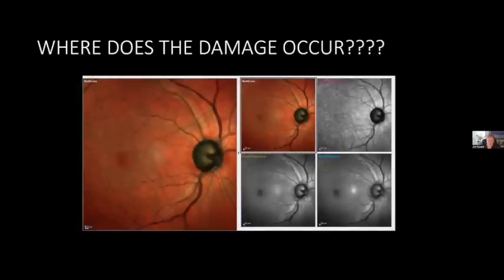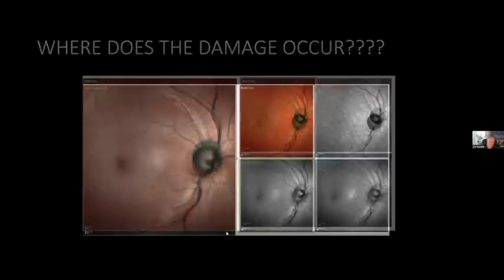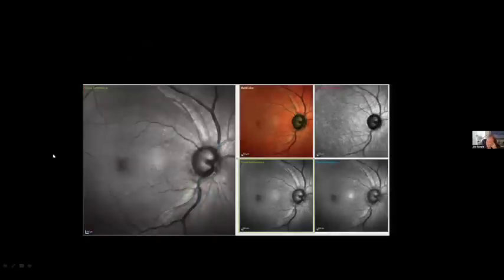This is a multicolor image of a patient who I've seen for years who has advanced glaucoma. Now, this is not a true color picture, but one of the advantages of multimodal imaging is that it can highlight, for example, nerve fiber layer defects, which are hallmark characteristics of glaucoma. So this is a multicolor image here on the left. And then if we're using a green reflectance image, this highlights more anterior retina. And we can see these striations and these arcuate wedge defects that are very common in patients with glaucoma.